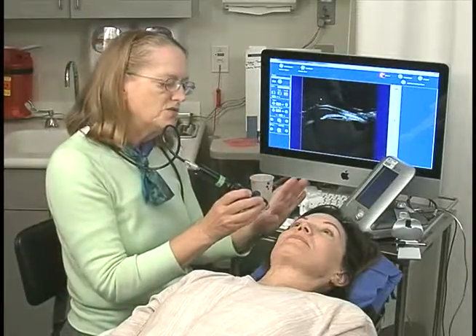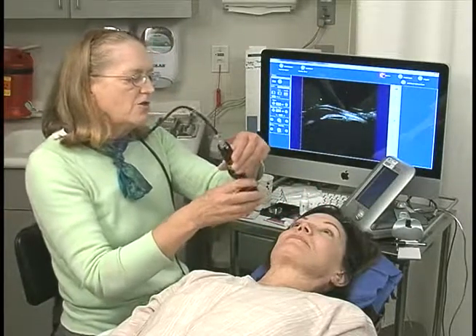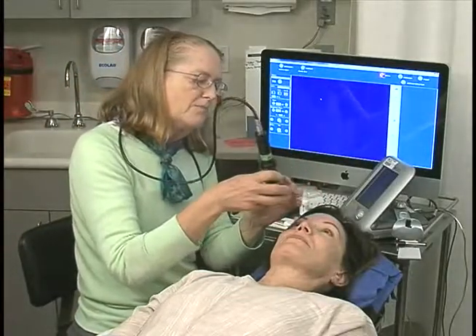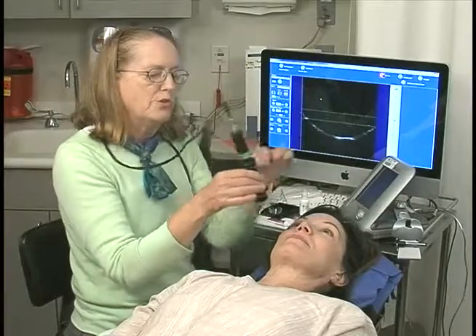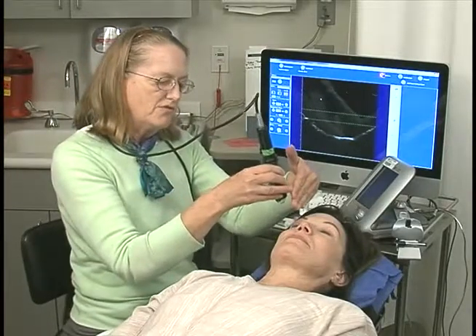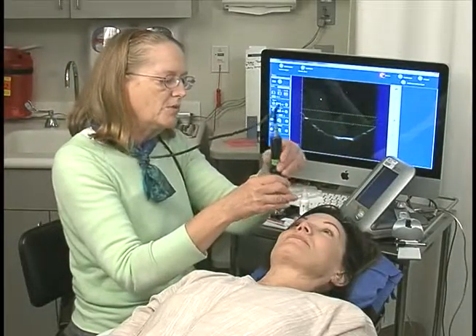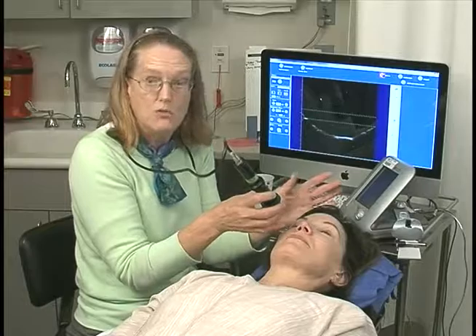I would label each of these as whatever clock hour I've imaged. For transverse, I would now take the probe — let's go back and I'll put the probe marker superiorly, and I'll do a vertical scan. So this will be superior, and this will be inferior. And I'm going to do what I kind of call a gonio view.